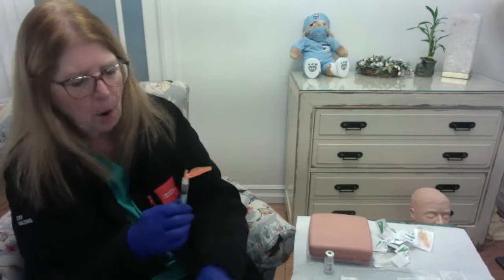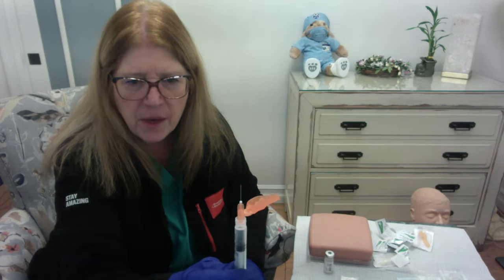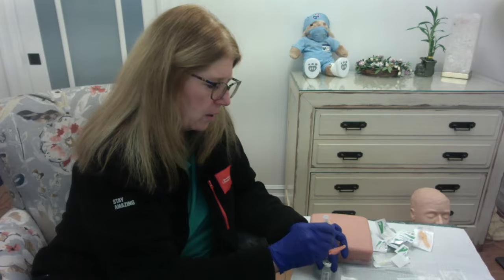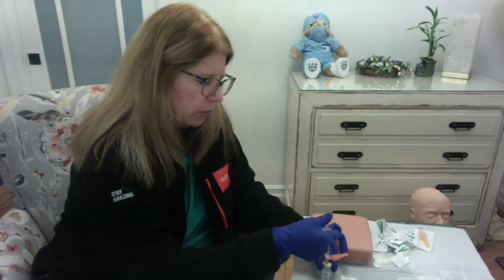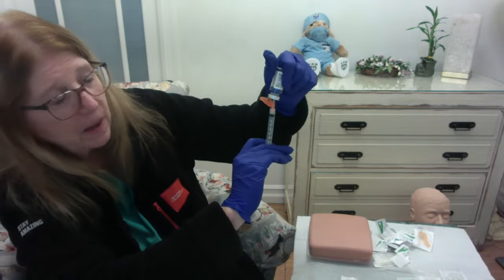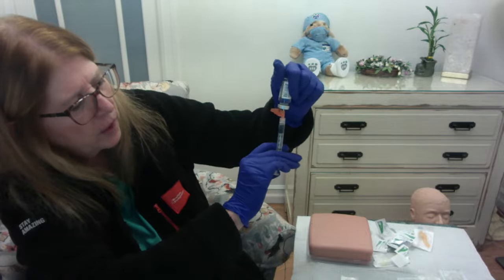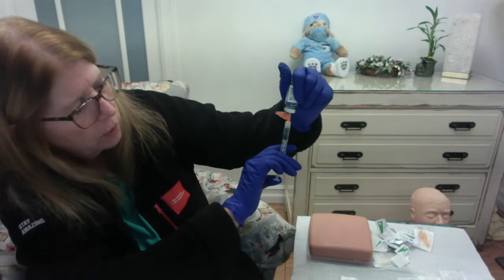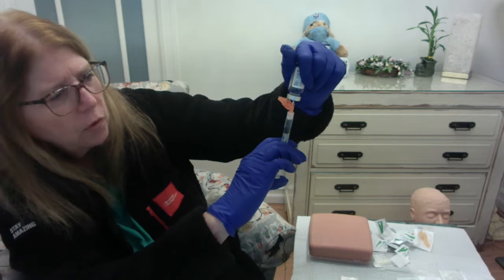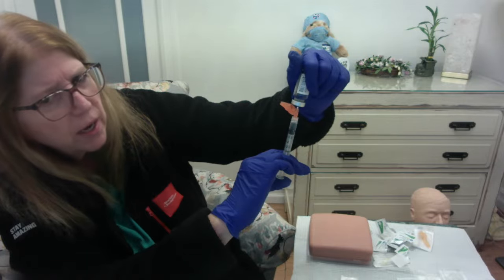Okay, I'm going to take my cap off. And you see, this is a small needle, not quite as small as the insulin one, but very thin and still pretty short. Okay, I'm going to go into the bullseye here on my vial. I'm going to push in my air. I'm going to do that flip, get that window facing me, and I'm going to help that plunger pull back a bit to get to the 1 milliliter mark. So I already see that I have some air. I think you can see that there up at the top. So before I even take the needle out, I'm going to push this forward and see if I can push that air back up into the vial.